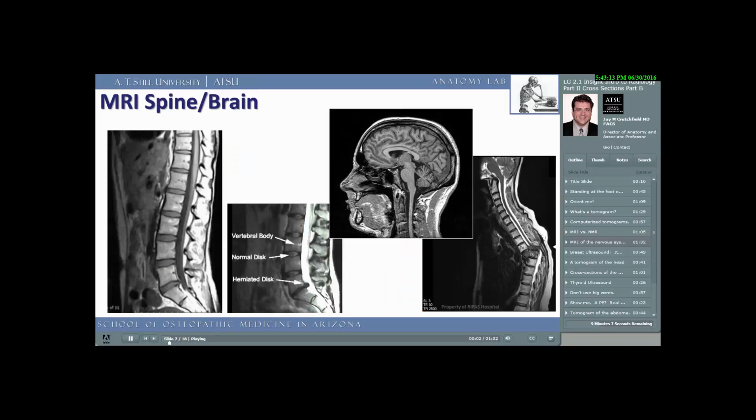So let's take a look at the imaging technology an MRI scanner can give us today. If a patient complains of back pain or musculoskeletal pain, they will usually benefit most from an MRI scan of their back or spine. MRI is the preferred imaging modality for musculoskeletal complaints. Why? It's based on water content and proton spin, and muscle tissue has a lot of water.